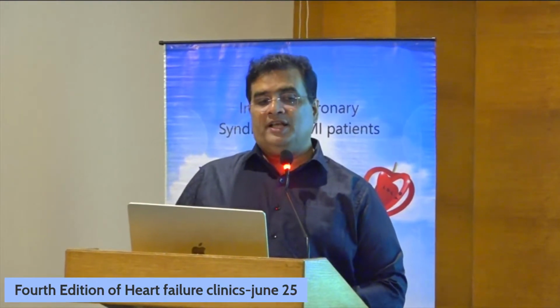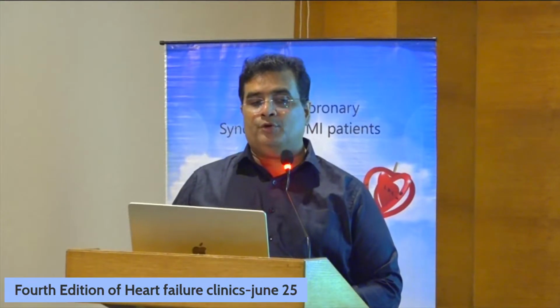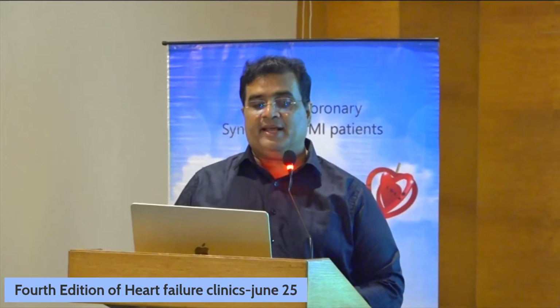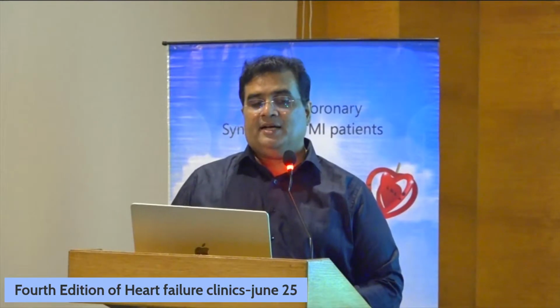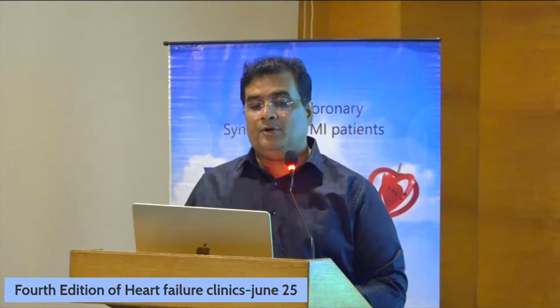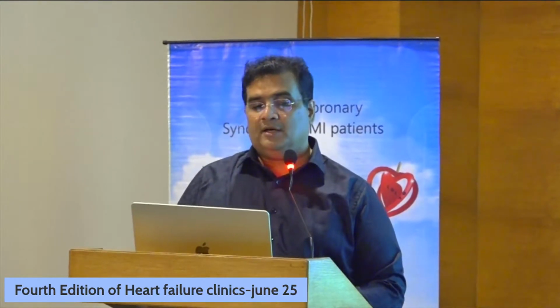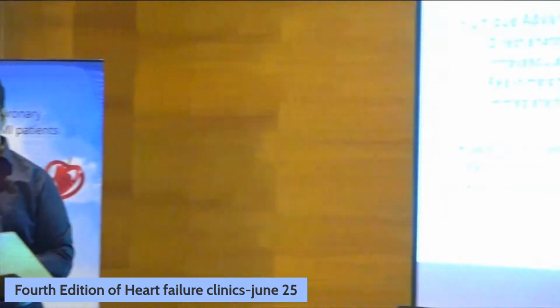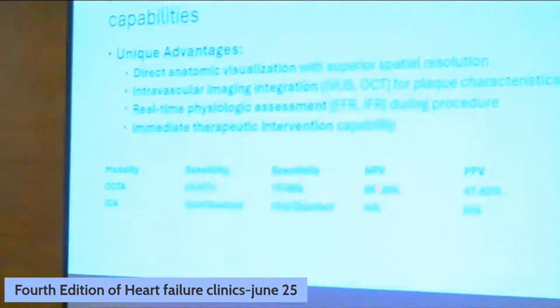Now, when we go to invasive coronary angiography, we do IVUS, OCT, FFR, and compared to sensitivity, invasive is the gold standard, and specificity is also very high. But for negative predictive value, invasive coronary angiography is not the test, CT coronary angiography is the test.